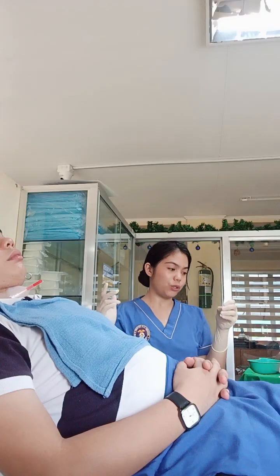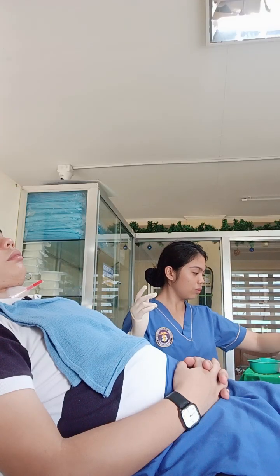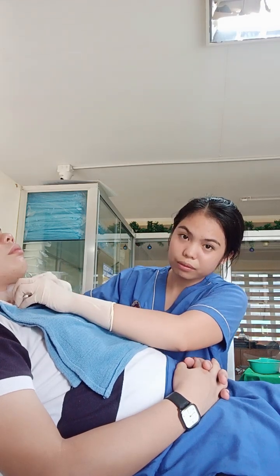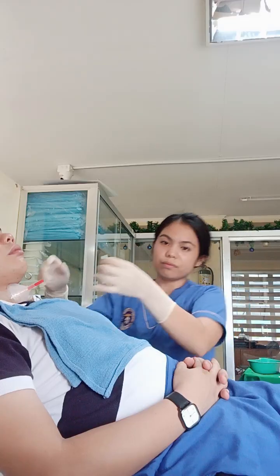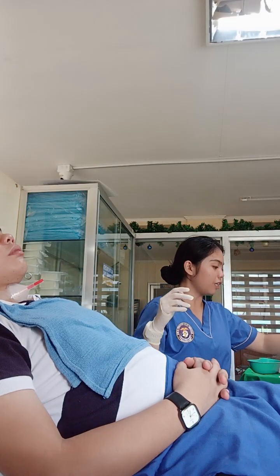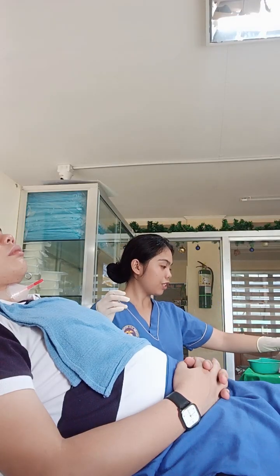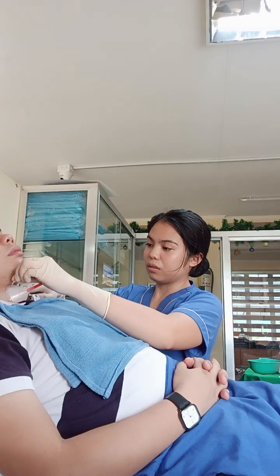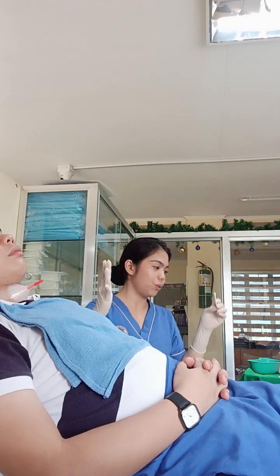Discard after each stroke. Repeat the procedure until the tracheostomy incision site is fully clean, discarding after every stroke.